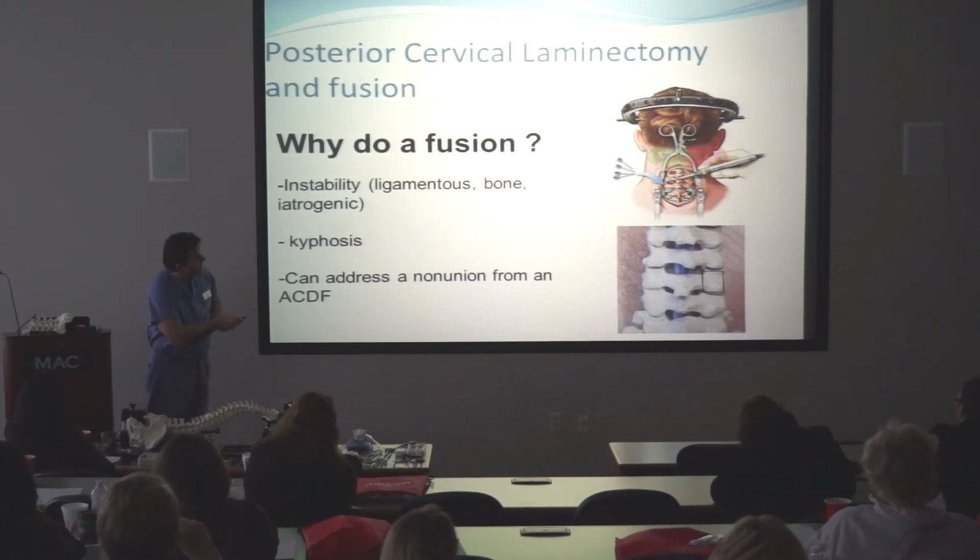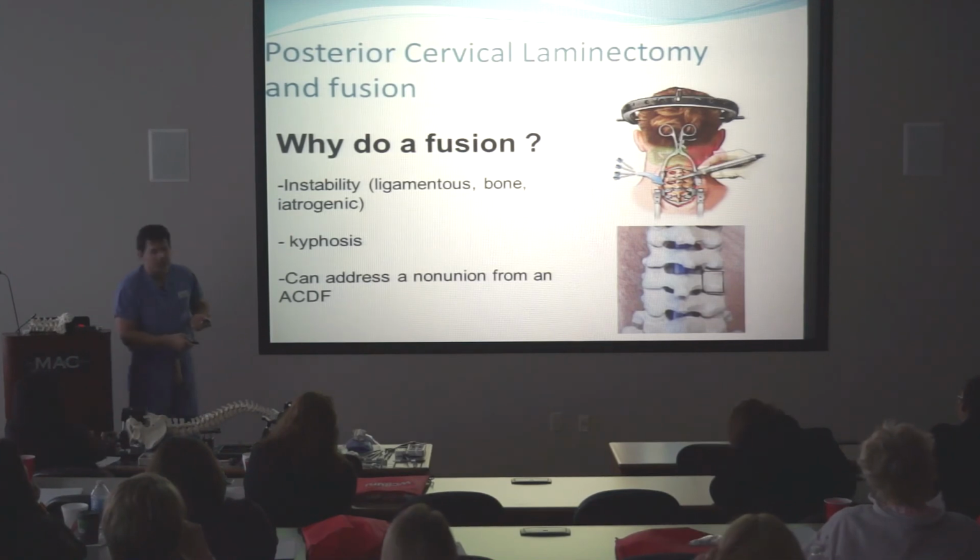So that's with the laminectomy. Then we'll do a fusion, which is where you see the screws and rods. Very similar to pedicle screws. They're just a version of it for the neck.